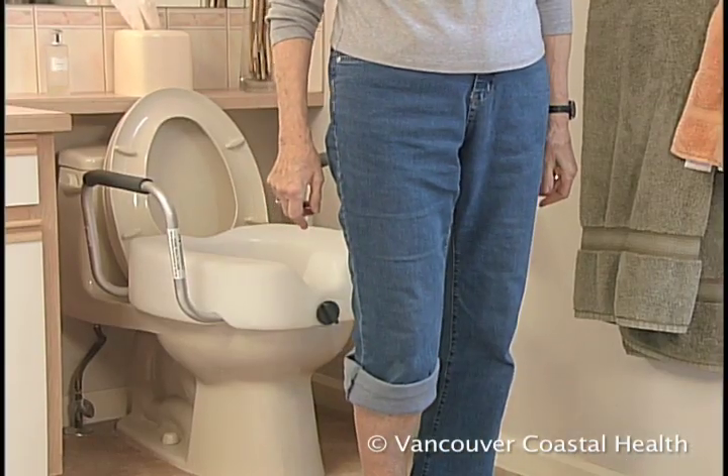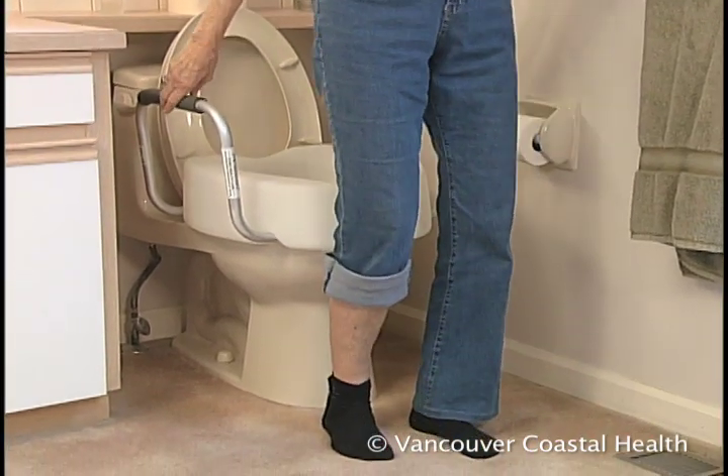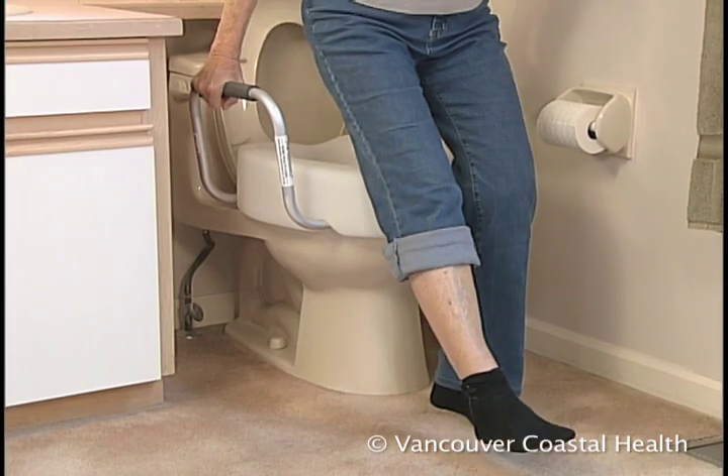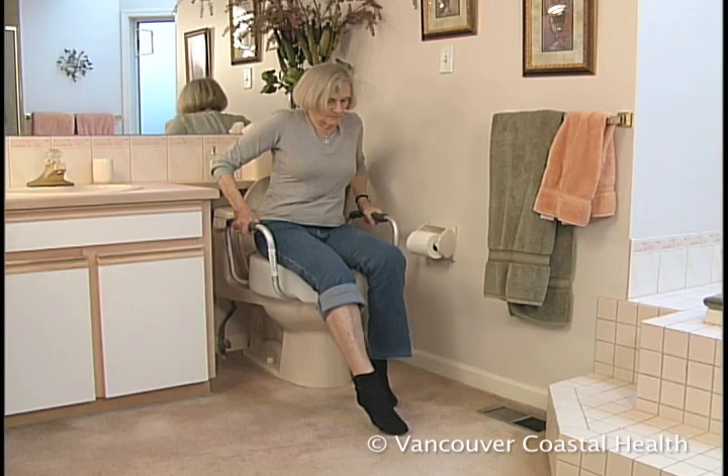To sit, back up to the raised toilet seat as you would to a chair or bed. When you feel the toilet behind your legs, extend your surgical leg, bend your good leg slightly, and using both arms, lower yourself onto the seat.